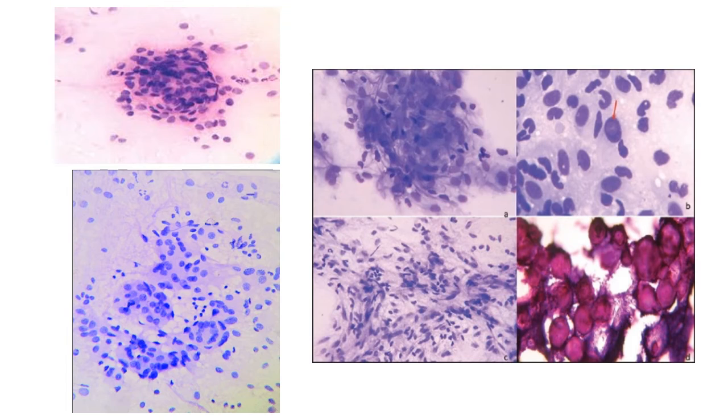So what do you see here? You see the characteristic whorl and a syncytial arrangement of these tumor cells. There may be some degree of pleomorphism, but however, it is usually not seen. This is a case of a fibroblastic meningioma. And what are these? These are the psammoma bodies or the calcific bodies that you see in case of a meningioma. And what are these? These are again the whorls that have been highlighted here. So these are the whorls.